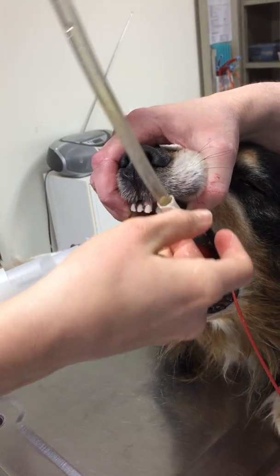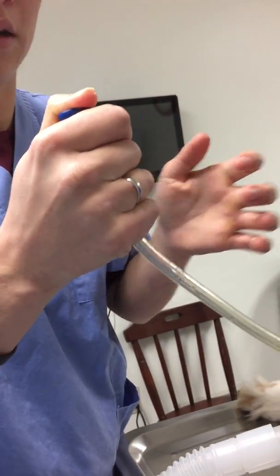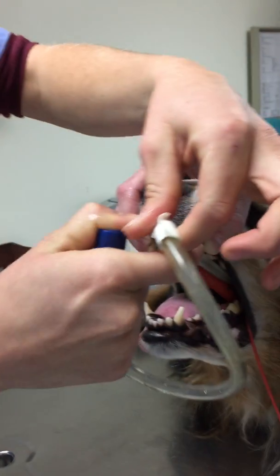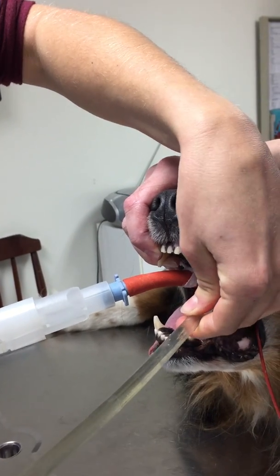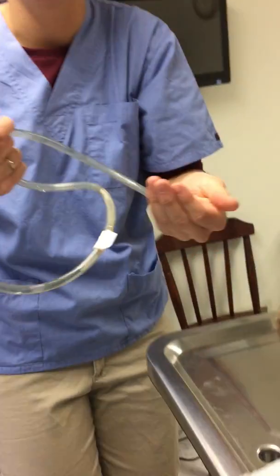So we have that confirmed, and now I'm gonna pull it out. I'm gonna plug the end here to make sure that even if we have any medication or anything in it, we're not gonna let him aspirate that. There we go. Thank you.